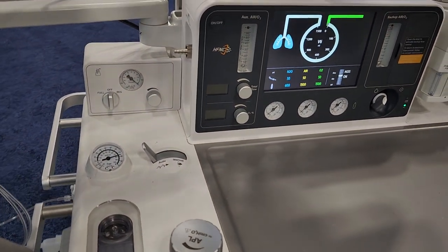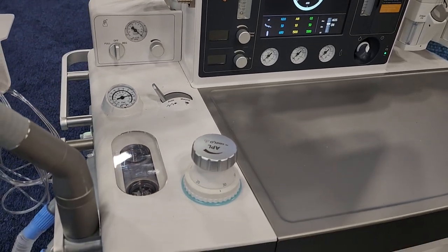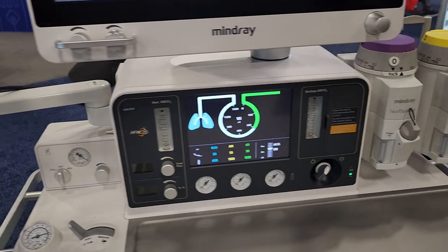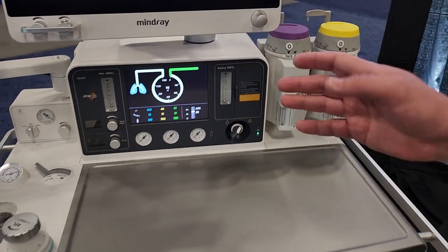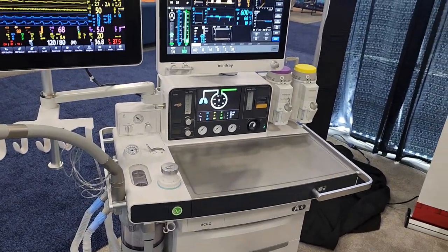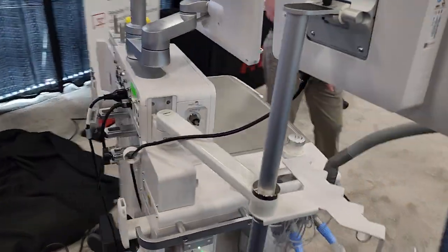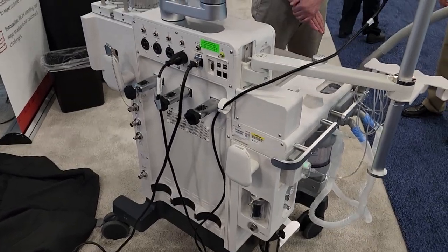We have a display for the user to see what the ventilator is doing at the time. We have a one-touch checkout procedure — that means the user just sets everything up, pushes one button, and the machine goes through all self-checks by itself. No kidding — that's so easy. What a well thought out machine.